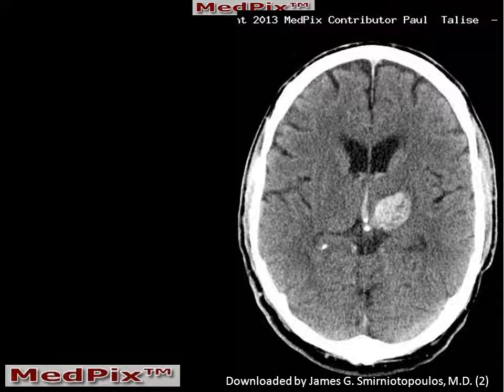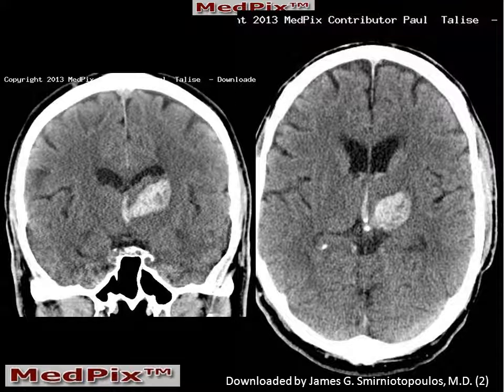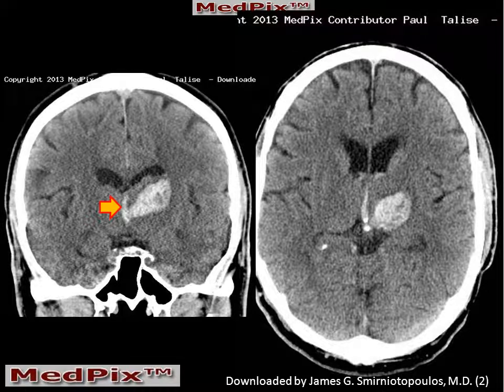A non-contrast CT was performed, which demonstrates an oval area of increased attenuation in the area of the left thalamus, as well as blood in the third ventricle. These are confirmed in the coronal reconstructions, which also show a thalamic hemorrhage and third ventricular blood.